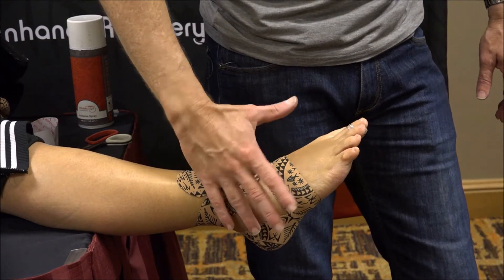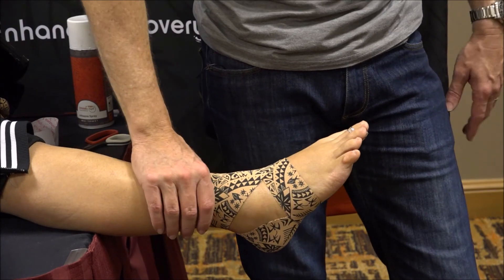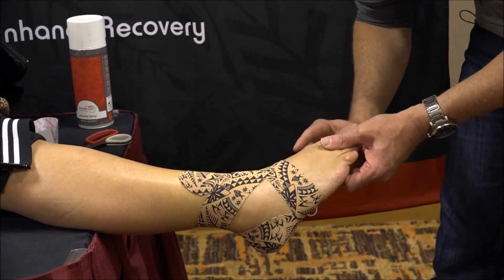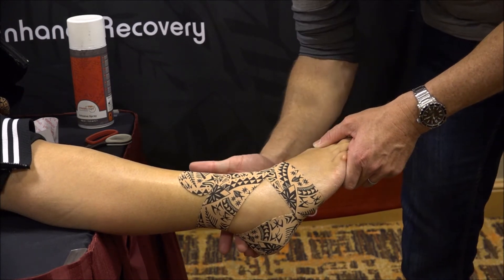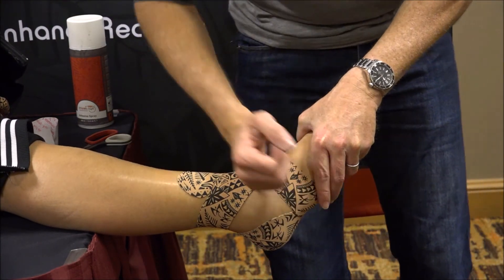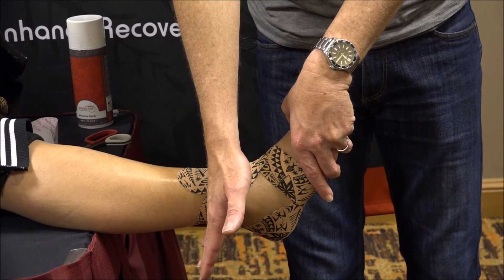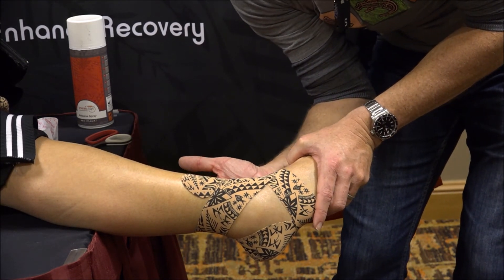If there is a lateral ankle sprain or chronic lateral ankle sprain, we're not going to do that — we'll show you a different technique for that. So to recap: plantar flexion inversion, big toe flexion — come off the big toe, through the arch to the heel, around the heel but underneath, then lift up and lock off, or go all the way around to give a bit of that compression. Dorsiflexion inversion for tibialis anterior; plantar flexion inversion behind the malleolus for tibialis posterior.